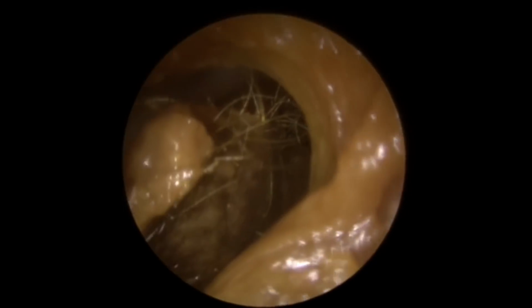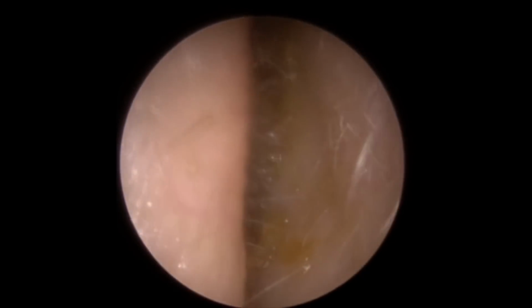So this is the second patient now in the compilation. So this patient's come through with a quite blocked up sensation in both ears. Hasn't had the best of experiences in the past with earwax removals.